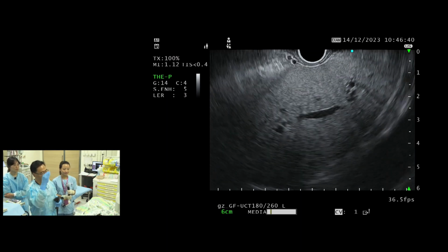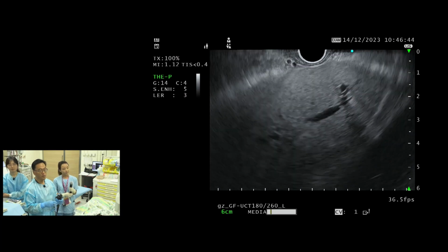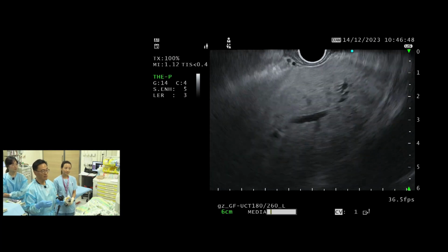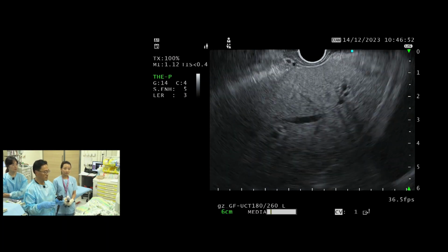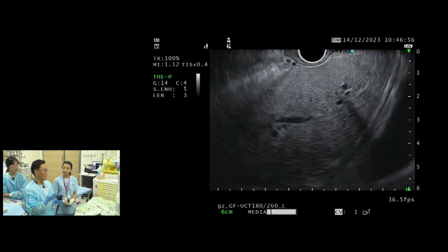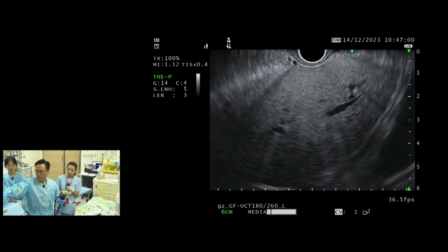I like to go down and then up, but it doesn't really matter. And if you're suspecting right heart failure as the etiology for portal hypertension, and your hepatic vein pressure is over 20, 25, then that also helps.